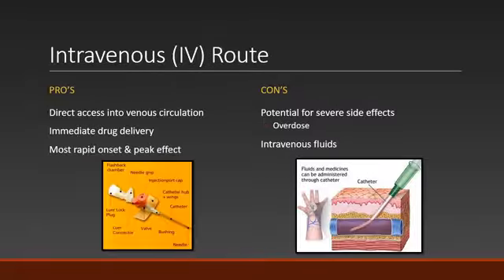We'll start by looking at the IV route. Hopefully by now, with this class, you'll at least be comfortable starting IVs, or at least know from a technical standpoint what you're doing. You may not feel totally comfortable; that really comes with time. But with the IV route, you can see some of the pros and cons.